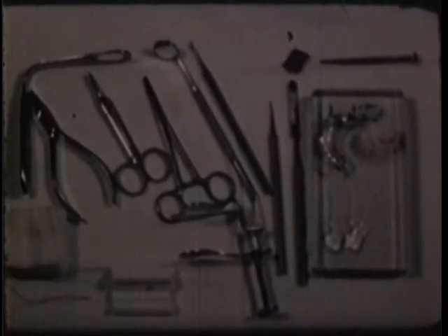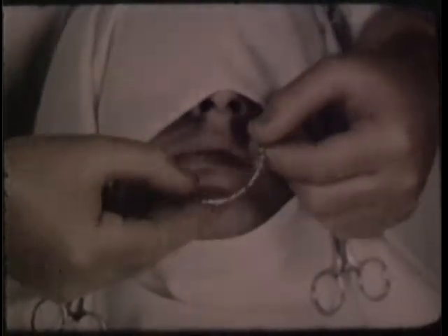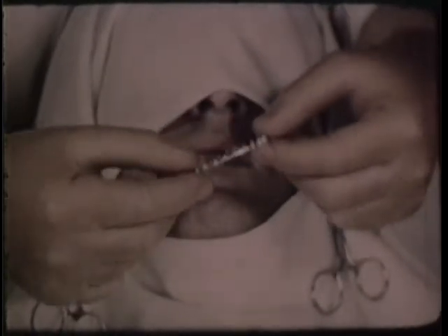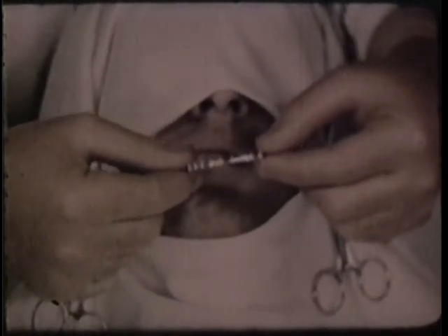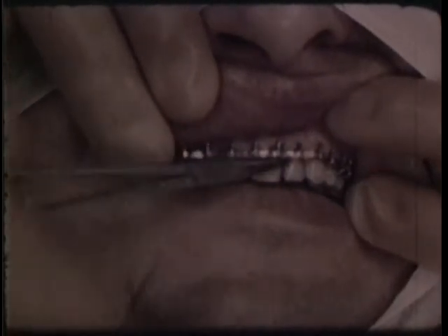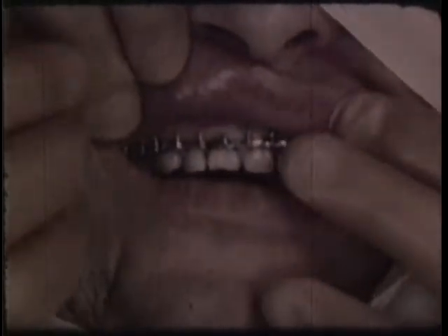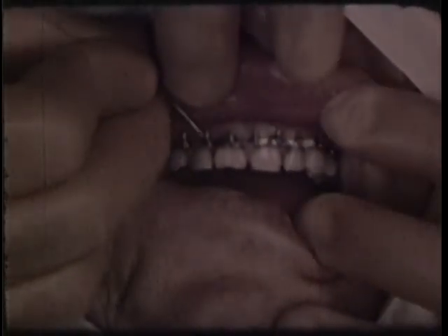Before reduction of the fracture begins, the patient is given morphine sulfate, 1/4 grain, and atropine, 1/150th grain. Third division nerve block anesthesia is used when necessary. In this case, a hook-type superior maxillary arch bar is used for traction or fixation during bone graft. A cast maxillary splint may also be used. The maxillary arch bar is held in place with twisted wires.